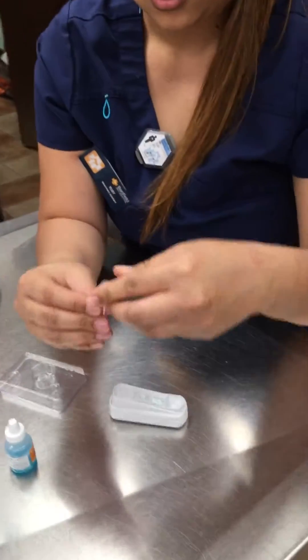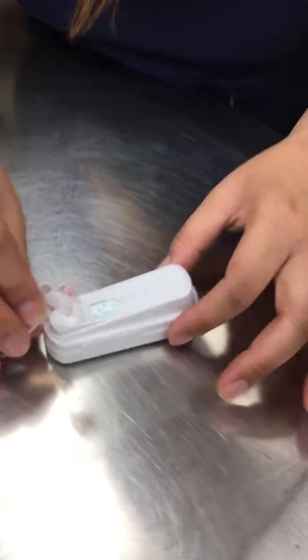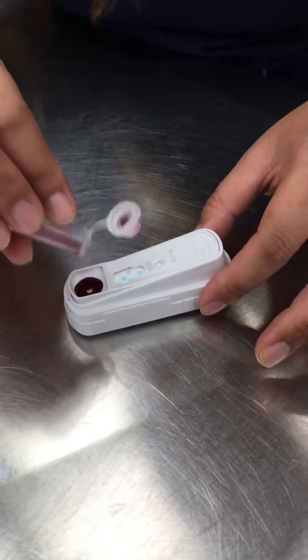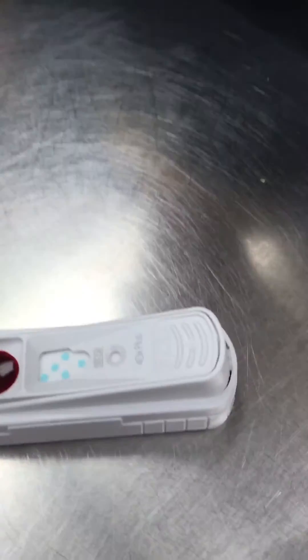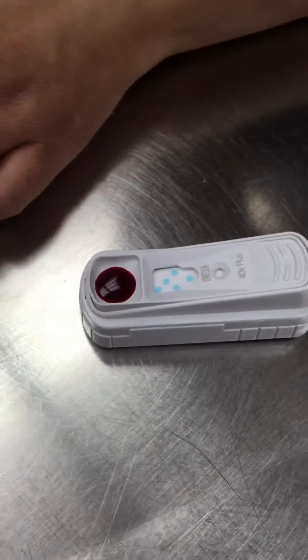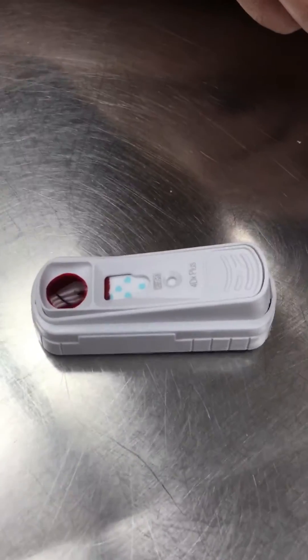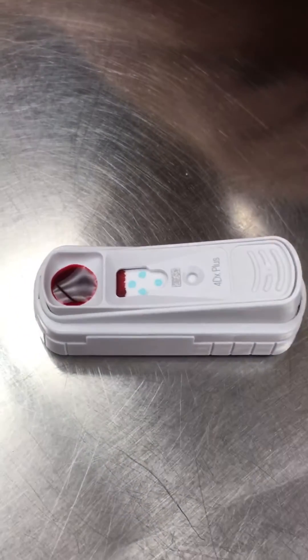Mix it nicely and stick this in the SNAP test. Then I wait for the blood to reach this little dot here, and then I will snap it.